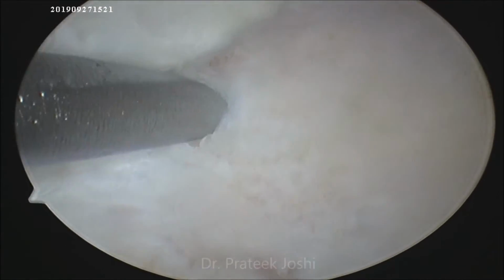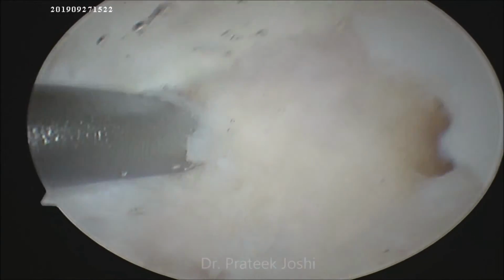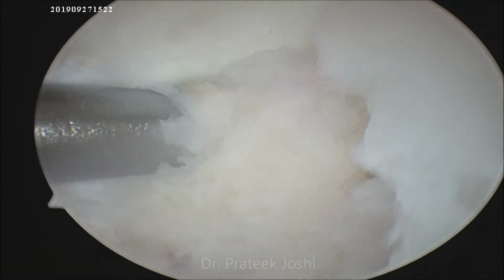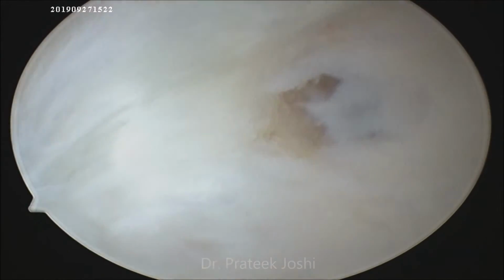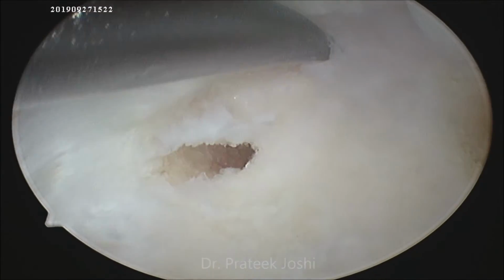The technique of microfracture is indicated when the cartilage lesions are less than 2 to 3 square centimeter in size. It involves creating holes of 0.5 to 1 mm diameter through articular cartilage into the bone marrow cavity. Following are the factors which are responsible for the success of the microfracture procedure.